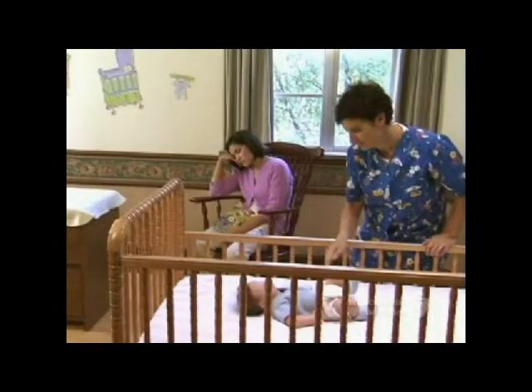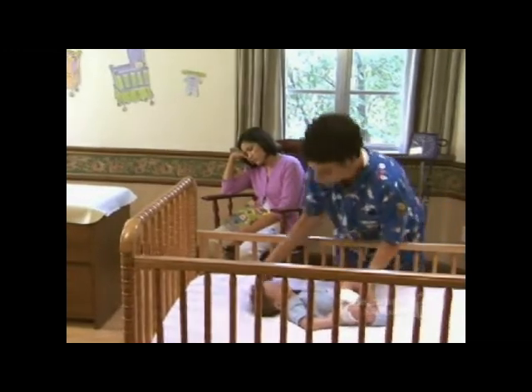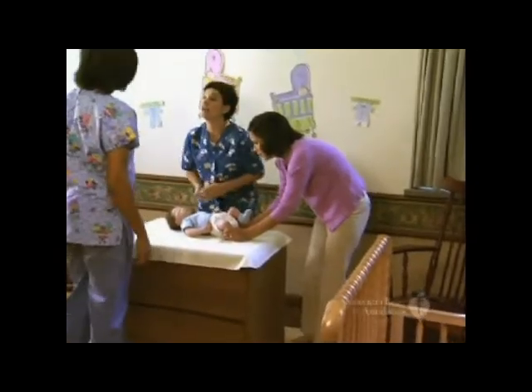Okay, now let's put together the entire sequence of one rescuer CPR for an infant. First, check for responsiveness. Jesse? Jesse? Oh, come on, sweetie. If the infant doesn't respond, shout for help. I need some help here. What do you need, Candace? Go ahead and call a code and get a crash cart, please.